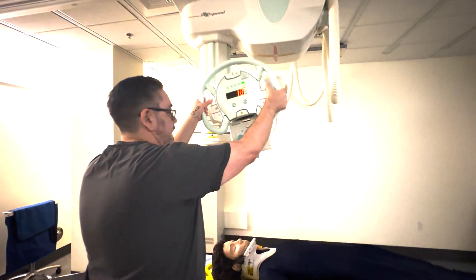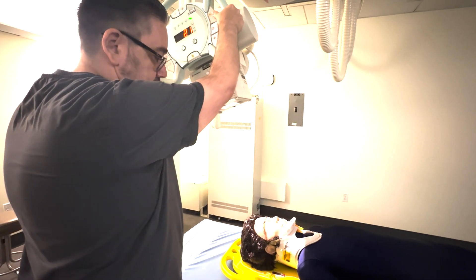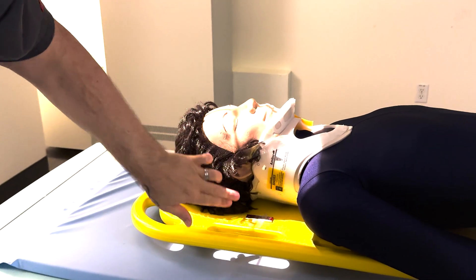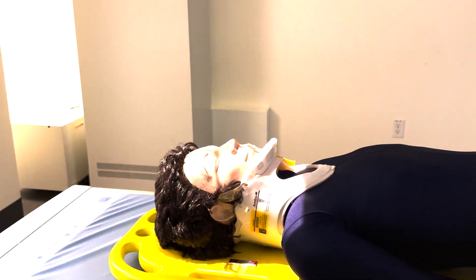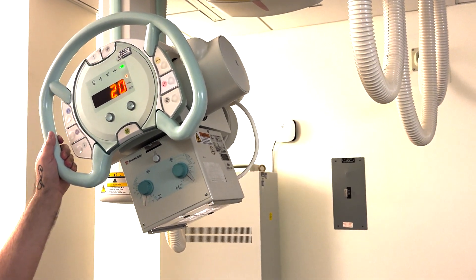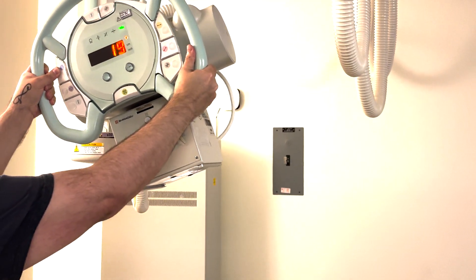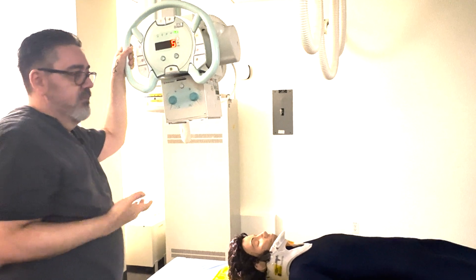We'll assume our patient cannot cooperate, and even if they could, they are not to cooperate — so all we're doing is having them hold still. I'm lining up the OML, using this line here to gauge where the OML is. I don't know how many degrees that is until I look at the X-ray tube up here. So if we angle 15 cephalic from the OML, I can use this point as a reference — this is the OML at 20 degrees caudal. So I'm going to take 15 degrees away from that. Now I have 15 cephalic from the OML.